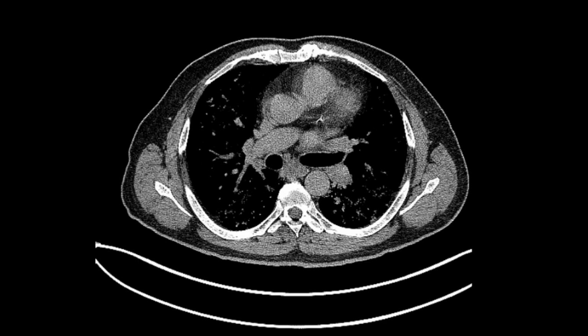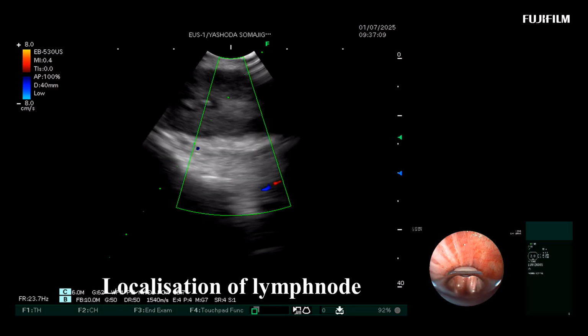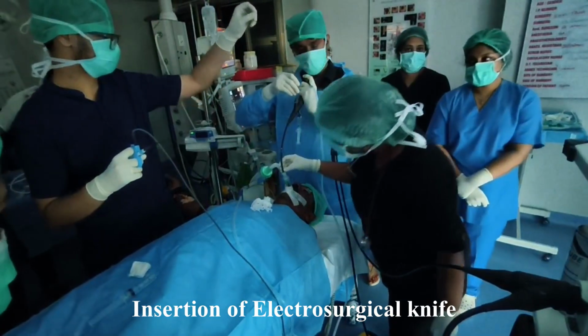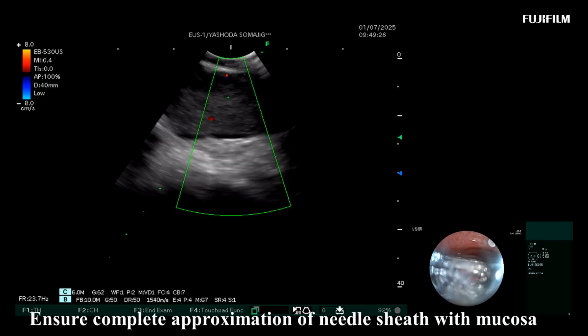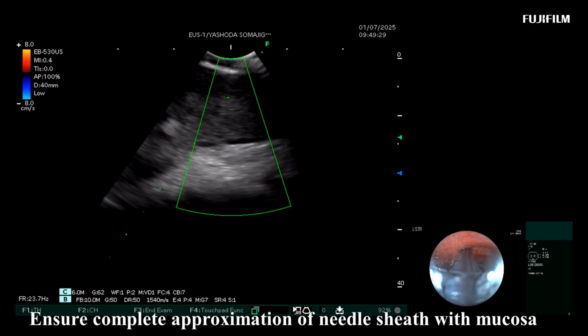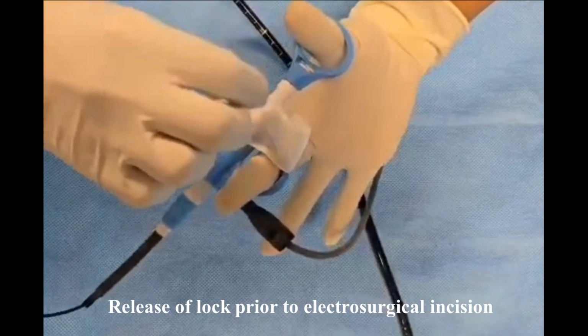So with this, now we'll see a patient who presented to us with a subcarinal mediastinal lymphadenopathy. First, we try to localize the lymph node and make sure adequate contact between the EBUS scope and the lymph node station. Now we pass the electrosurgical knife, which is locked inside the working channel of the scope. And after that, we ensure that the needle sheath is pushed out and ensure complete approximation of the needle.